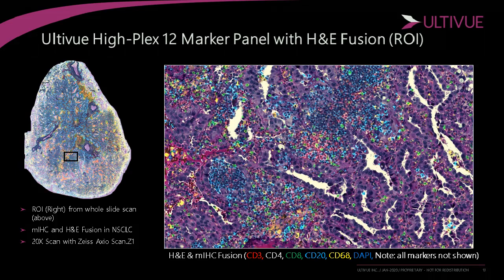Therefore, allowing pathologists to add precisely on an H&E slide the subtype of infiltrating cells stained by multiplex fluorescent IHC can deliver more accurate prognostics and patient stratification for treatments. So integrating the cell-level information that you have with the multiplex IHC with the context-specific information of the microenvironment that comes from the H&E.